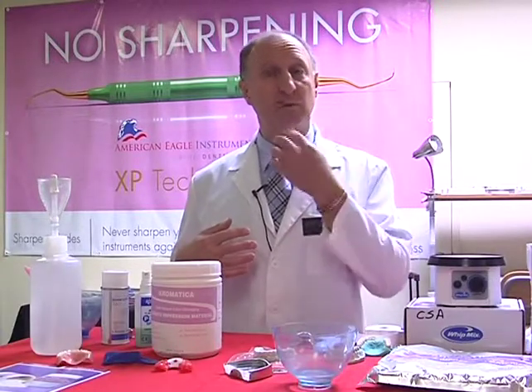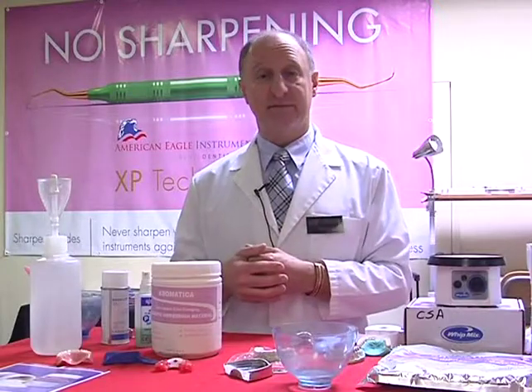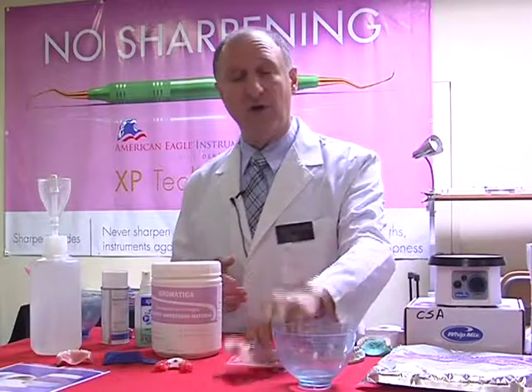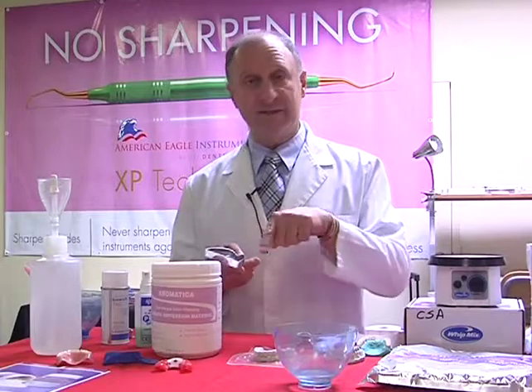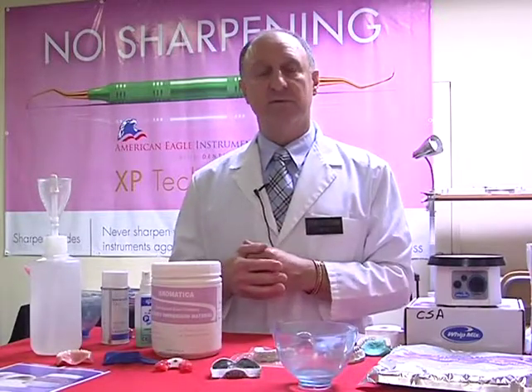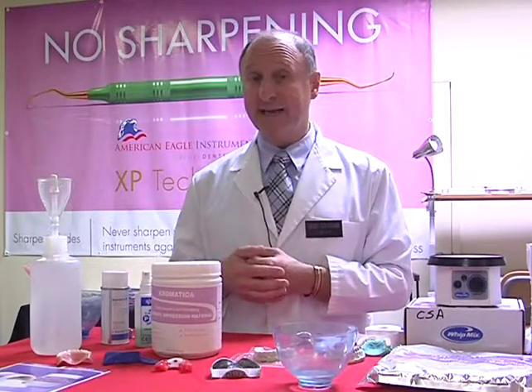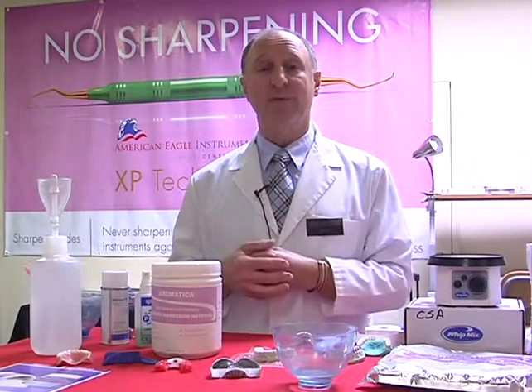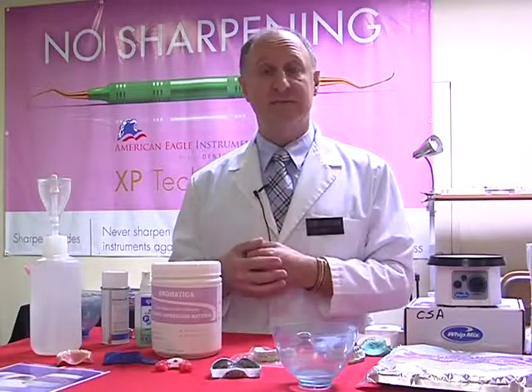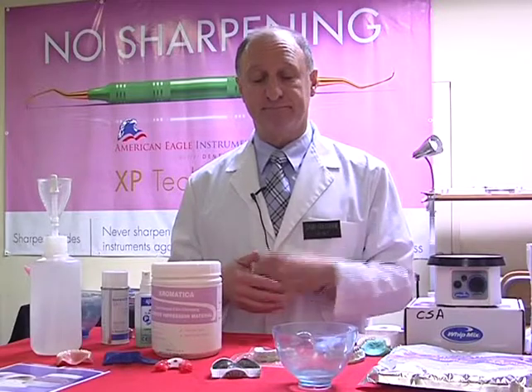It also helps to wet the mouth, which of course when we're using an alginate is going to break down the surface tension. So that way I will not now have to wet my finger on the surface of an alginate, which a lot of people out there are doing. And in this case, it's going to produce a much smoother surface. Now, if the patient's a little bit elderly, or if they might have a thicker, ropier saliva, that room temperature water that they're going to rinse through will be broken down as well.